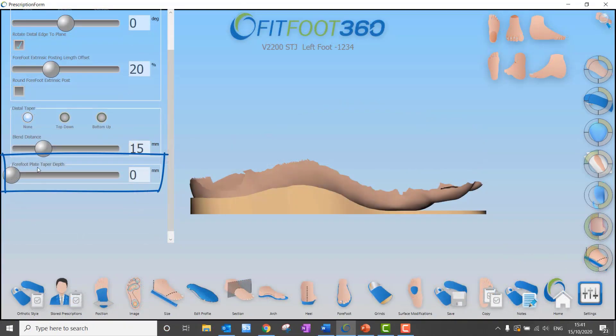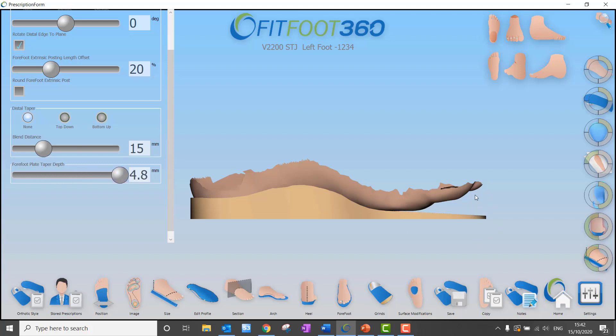We can now taper the distal edge of a full foot device, whether we are increasing the thickness and maintaining that thickness of 3 millimetres, or more importantly now, taper it down to zero. So you have a lot more control over the thickness of your device whether it's a shell or a full foot.